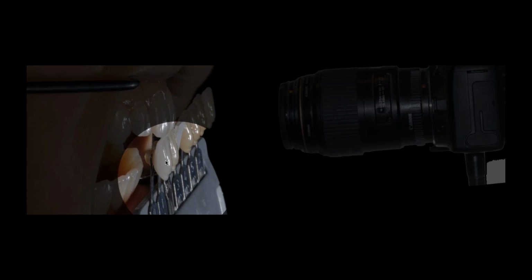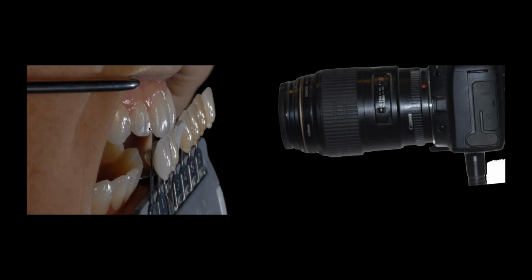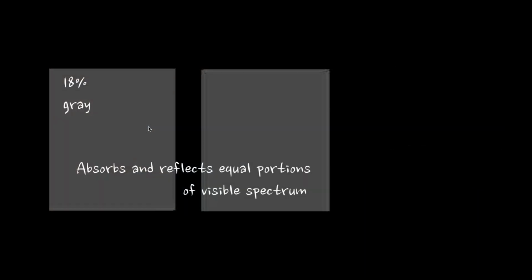I know I see people put the teeth next to them. That's a mistake. One, it creates a shadow, and unless you're changing the angulation of the tab and shooting from an angle, it really becomes more problematic than it's worth. Although there are some little tricks you could do with it that are helpful for you down the road. But for basic shade taking, I want incisal edge to incisal edge, all in the same plane, make it easy for ourselves.